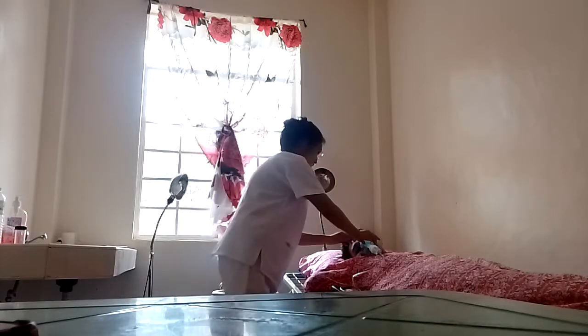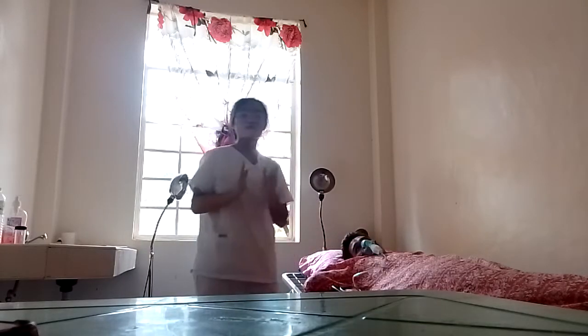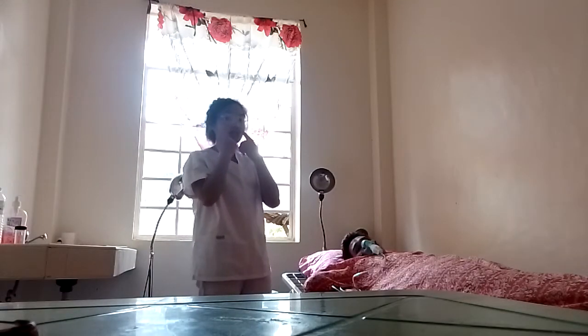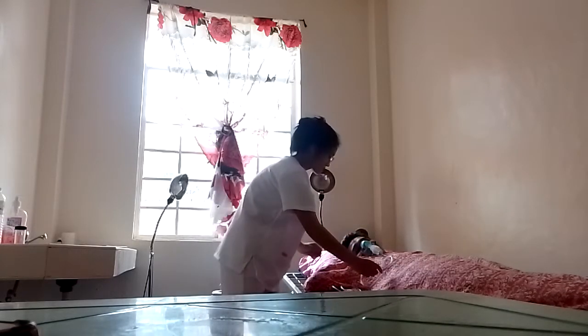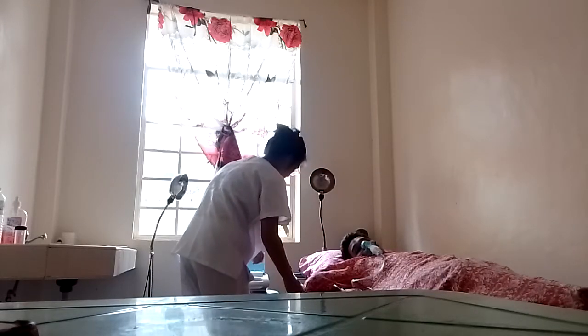Okay, so next step that we need to do is we need to assess client nostrils every 8 hours. Okay? So ato siyang i-check every 8 hours to prevent irritation or dryness. Okay, basig na rashes na niya ato ang pasyente diri, so dapat nato siya i-check every 8 hours. Okay na ka, sir? Okay. Then ato lang po siyang tarungon. Basta niya dito, wala siya air.